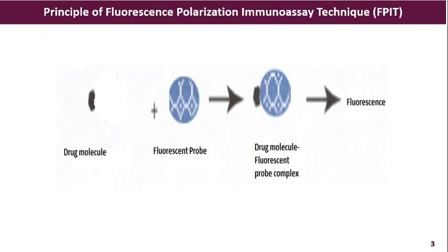The fluorescent probe on conjugating with drug molecule will give a different intensity of fluorescence compared to the molecule without the conjugation of drug.